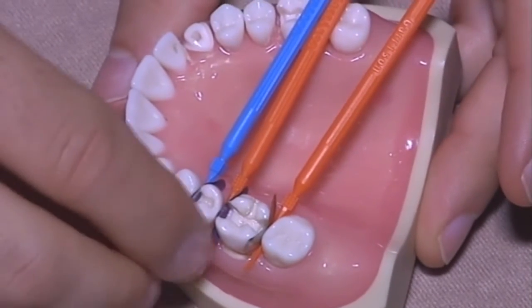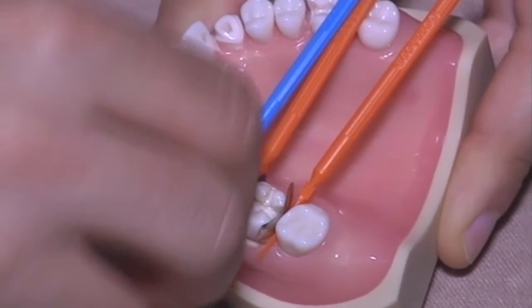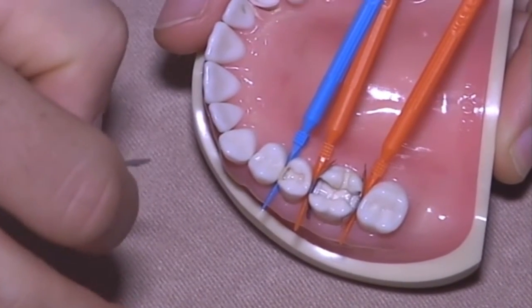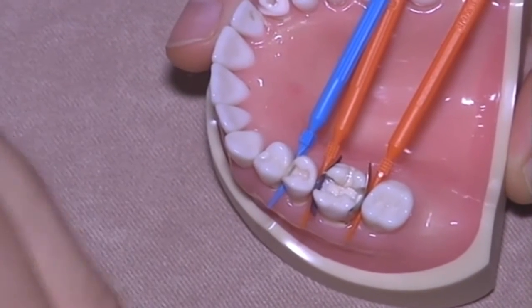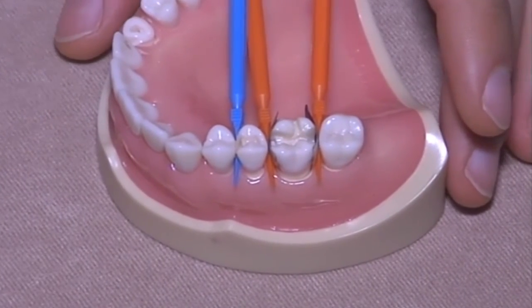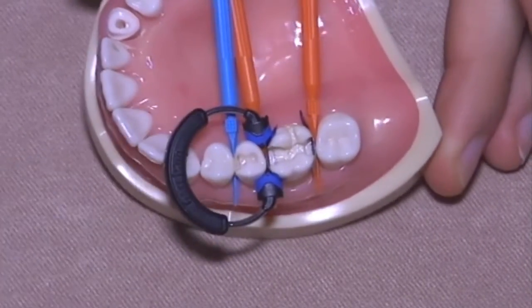Technically, you can even remove everything. I just suggest to remove the matrix without removing the wedge. Why? Usually bleeding. Yes, if you have an interproximal caries, you have for sure gingiva which is inflamed. So let's leave it there, and we can immediately move to perform the other two.